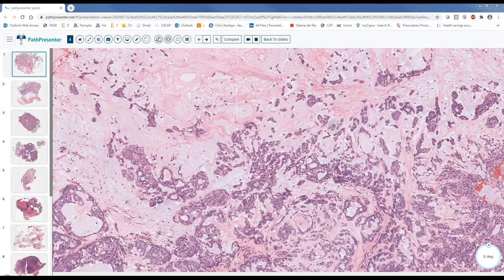Triphasic is a genius word, but let's go with biphasic, as we usually like to describe lesions as either one component, monophasic, just epithelial or mesenchymal, or biphasic, meaning that it has both the epithelial component and the mesenchymal component. Okay, the background we see here.